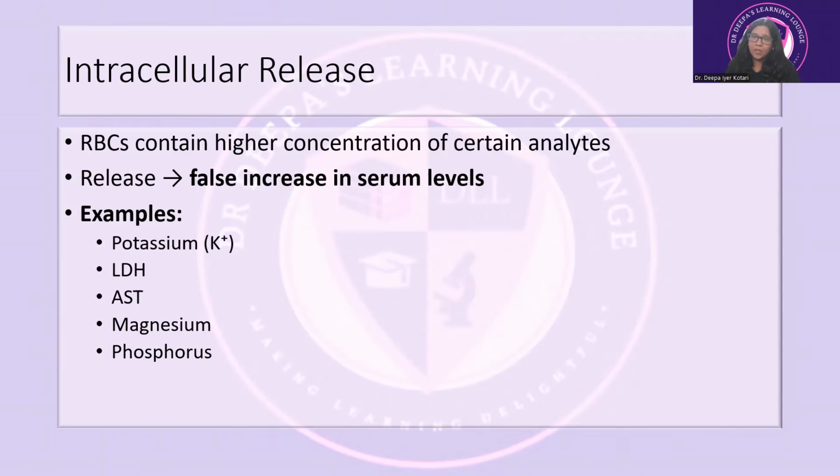Whenever you have a hemolytic sample, these concentrations will be at a significantly higher level than the routine extracellular fluid values. Notable interference occurs even at very low hemolytic interference also. You can have a very notable increase on any of these parameters.